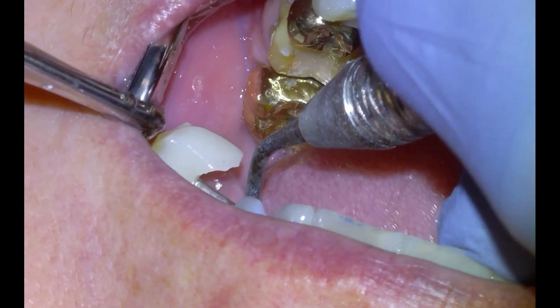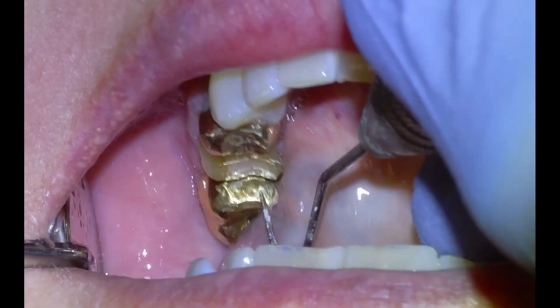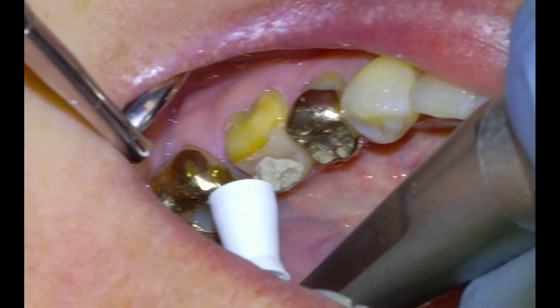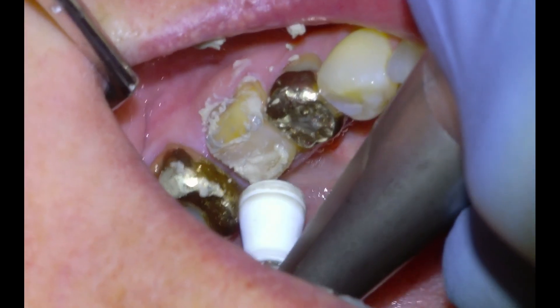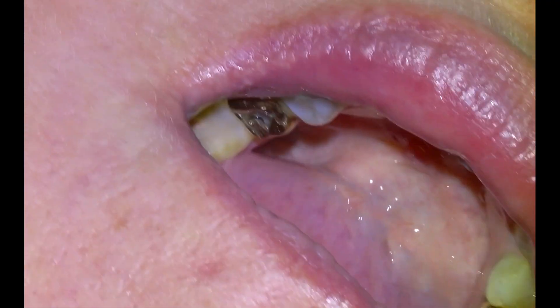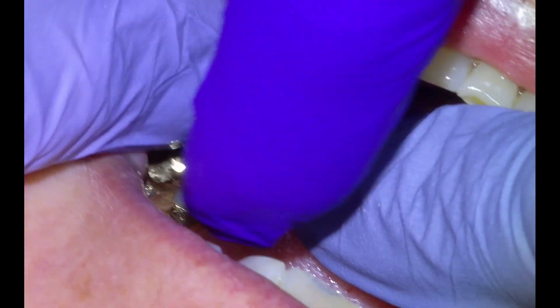We're going to get the patient back the next week, remove the temporary crown — which had a little chip in it — remove the temporary cement, and then give the tooth a pumice. I'm a huge fan of in-house zirconia milling. I've been doing it myself for about two years, everything from single unit crowns to full mouth reconstructions, anterior aesthetic cases, all-on-six zirconia hybrid fixtures — all done in-house. It saves a lot on the lab bill and gives you more control over the process and aesthetics.